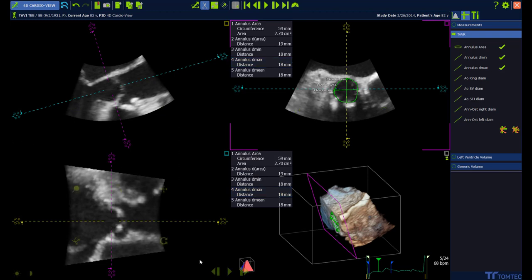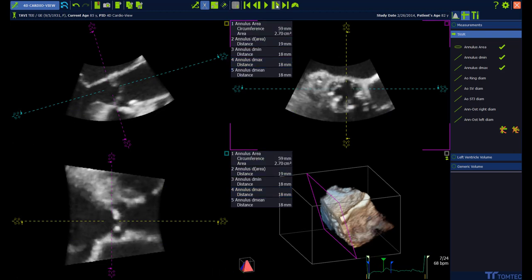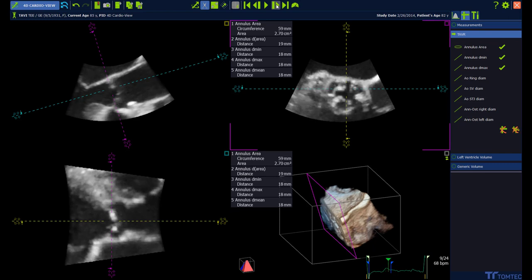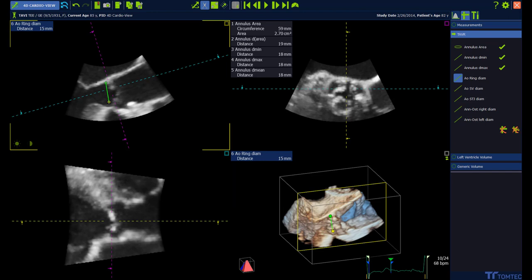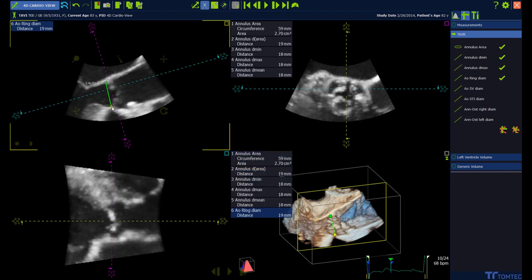The following measurements will be performed in end-diastole. Select the end-diastolic frame. Aortic ring diameter, aortic sinus Valsalva diameter, aortic sinotubular junction diameter, and the right annular ostial distance are measured in the current long axis view.